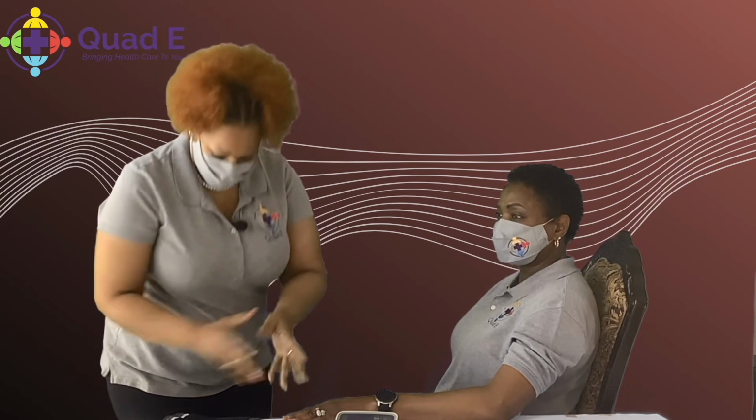Now, her arm is parallel to her heart. So that is very important. We want to make sure it's not too high or too low. We want to make sure that we have an accurate reading. All right, so we're going to start. I've already washed my hands, sanitized my hands before I touched Ms. Jeanette. She made sure I did it, okay?